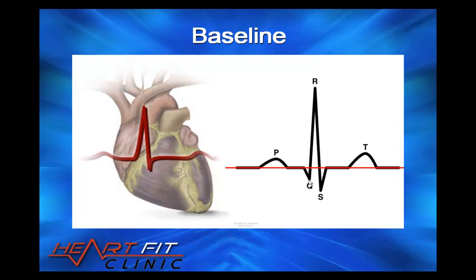Now, the reason we show you this slide is that every time an ECG has some electrical activity, via atria contracting or ventricles contracting or even the ventricles relaxing, it always has to return back to baseline. What we want to ensure most is that when the ventricles contract, which is the QRS complex, and then they actually relax, which is the T wave, we ideally want the ECG signal to return to baseline, as you can see here, before it actually relaxes.